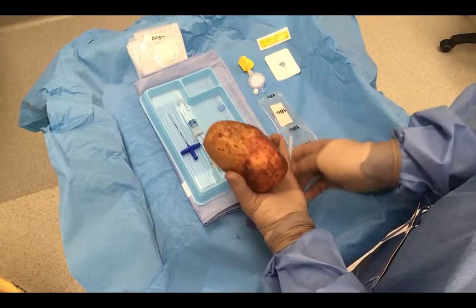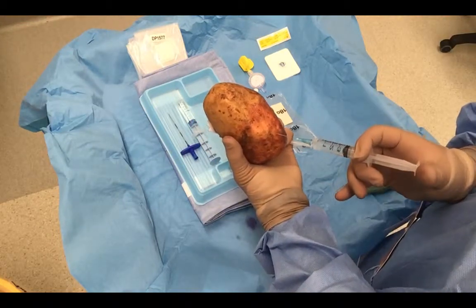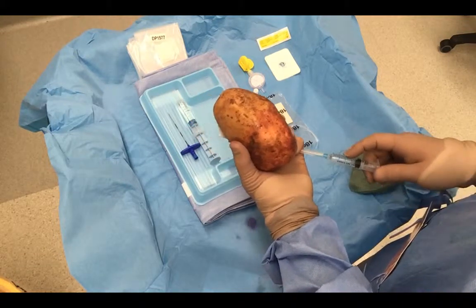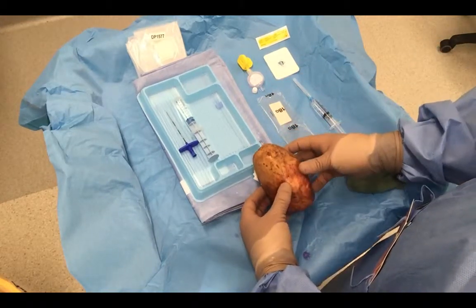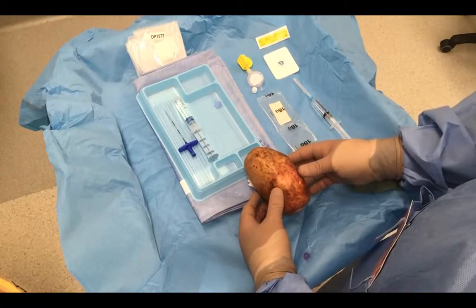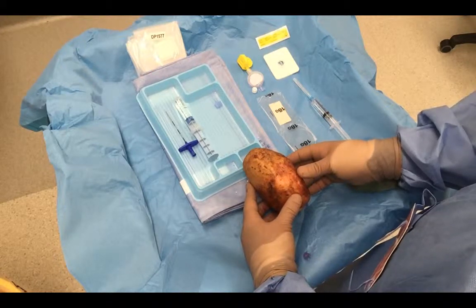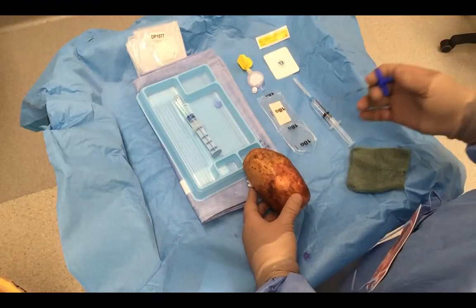So, our patient is sitting steadily. We're going to apply some subcutaneous local anaesthetic for skin analgesia. Patient positioning is everything, and this is no less true, certainly no less true, when you are inserting an epidural into a potato. So that should have had time to work.